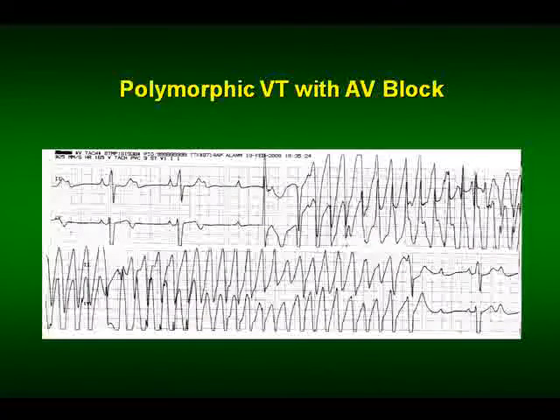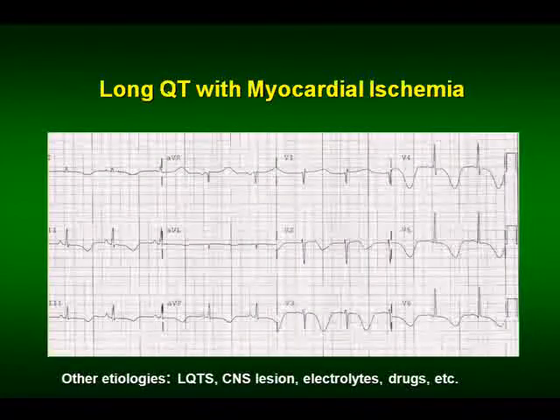You also have to think that the mechanism for death in heart block is not asystole. So in severe bradycardia, here's somebody in either 2-to-1 heart block or complete heart block. You can see that they have a long pause, and then they go into Torsade. And if we had monitors in the 1940s before we had pacemakers, this is how people with complete heart block die. They don't just go asystolic usually. Eventually you'll have one of these that just keeps going. So again, if you see this, the treatment is not treating the ventricular rhythm. The treatment is treat the heart block and reverse the situation.